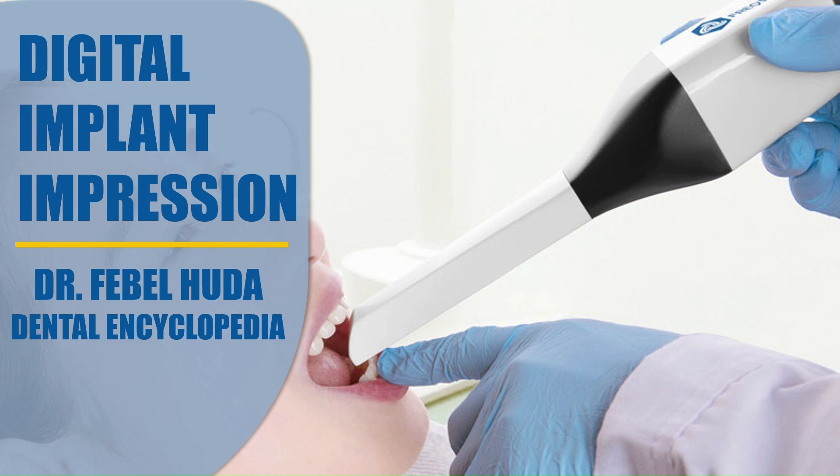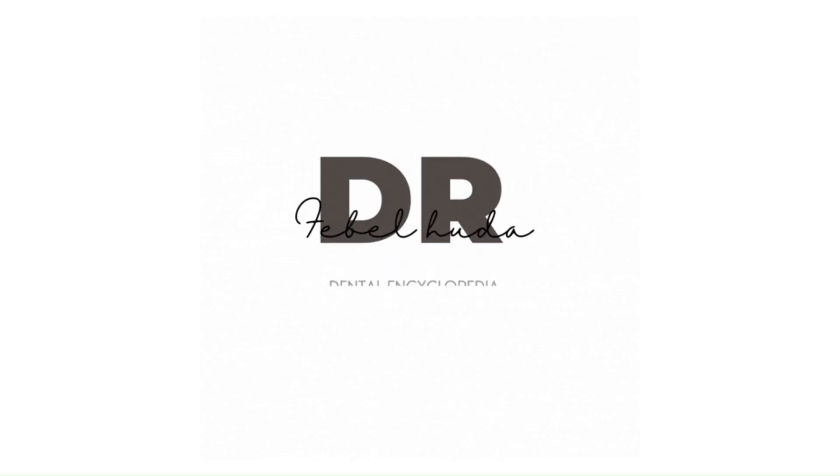Hi guys, hope you all are doing great. Today we're going to see a small video on how to capture a digital implant impression using a scan body. As the implant industry is moving more digital, this video is going to be very important for anybody who is going to make this transition. We're going to see all the steps involved in making a digital implant impression.